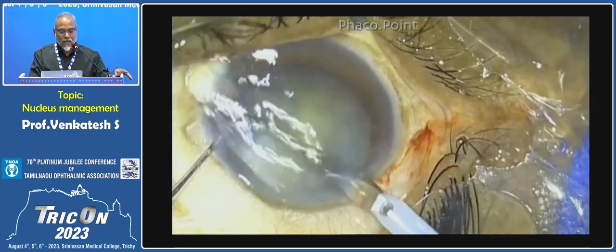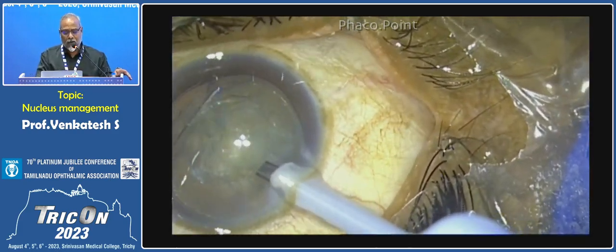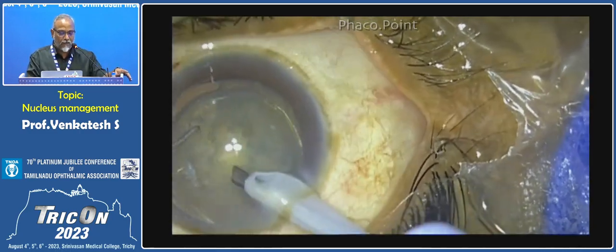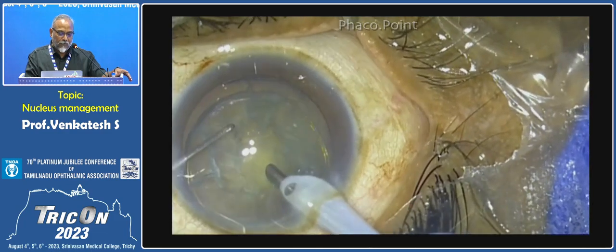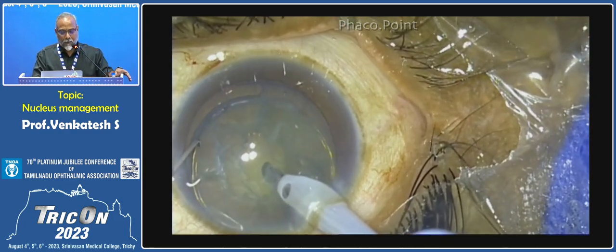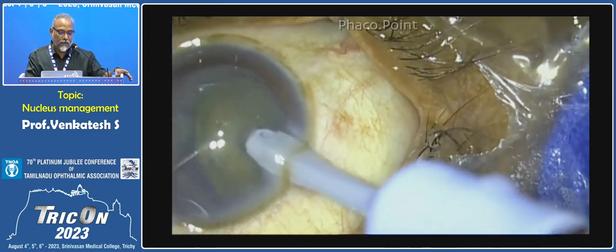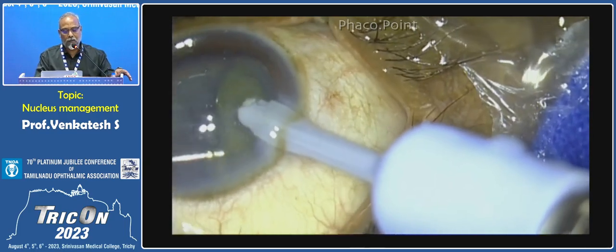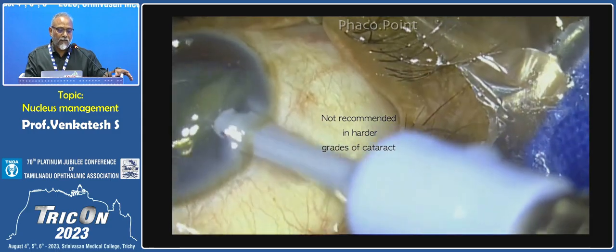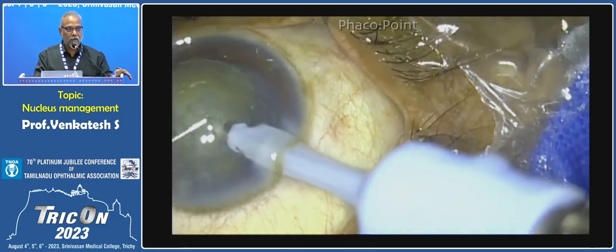Once I have delineated the endonucleus, I go in with a phaco probe. I'm using a vacuum of 300 millimeters of mercury so I can impale this nucleus and lift it up. You see that in a bevel down position, just giving minimum amount of phaco power, I'm impaling, holding it with vacuum, lifting it up, and then just bringing it up in the AC. So I'm just prolapsing only the nucleus or endonucleus, not the entire lens. And for this, it is enough that you have a capsular rexis size of just 5 to 5.25 millimeters.